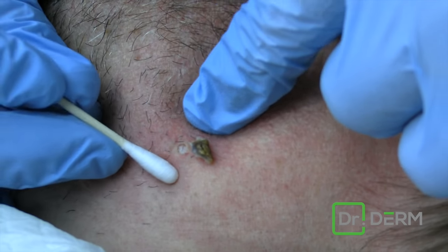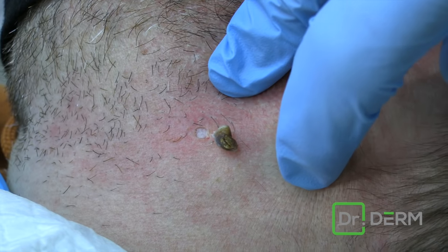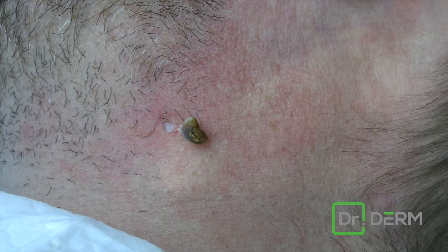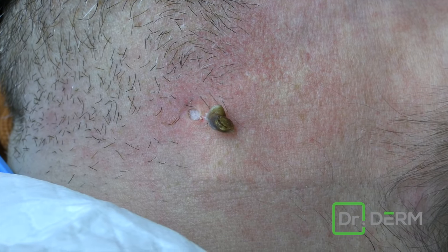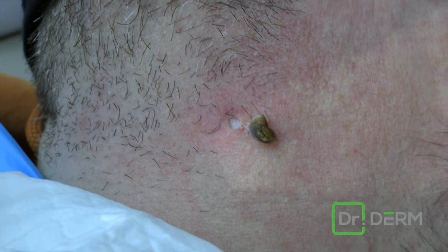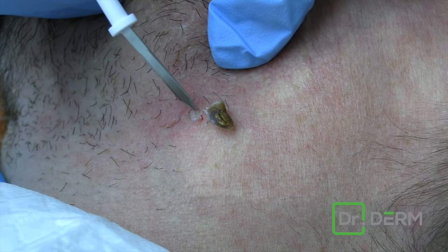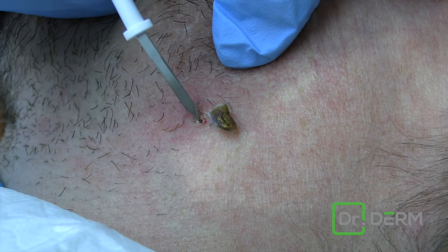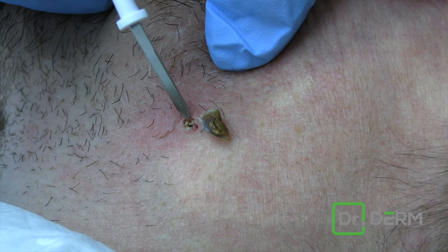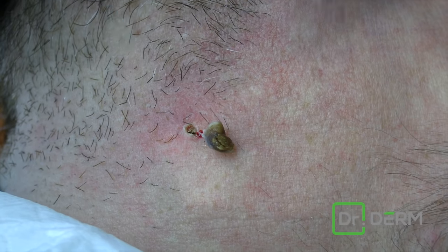So here's the deal — that little thing there, I find it easiest if you use a little heat to keep that from coming back. So I have my little electro desiccation here. I'm just going to put it on a pretty low setting. He's already numbed so he wouldn't feel this. And that's it. I think if you're just able to get the lining at the base, then he's not fighting this again. And look how it almost even shrinks that up — that's going to heal so well.